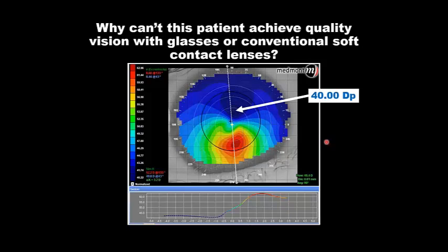and we're coming up with about 40 diopters within the pupil. We find the steepest point within the pupil, and we're at 63 diopters. So there's a 23 diopter distribution of power within the pupil here. For those of you with a corneal topographer, pull up your axial map, also known as sagittal or power map, and look for the distribution of power within the pupil. Is it symmetrically distributed? Is it wildly varied from one range of curvature to the other?